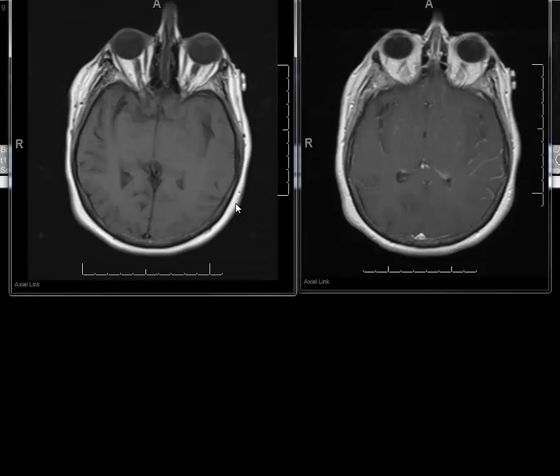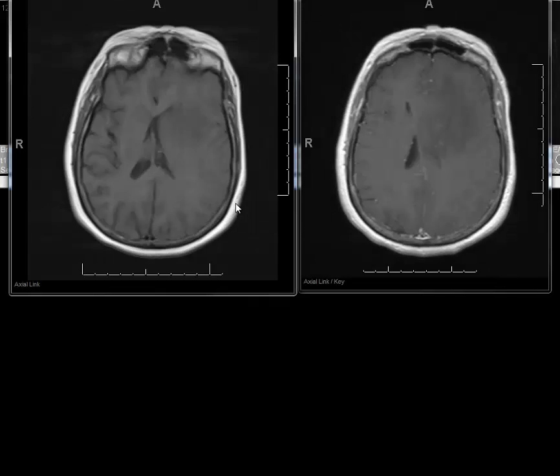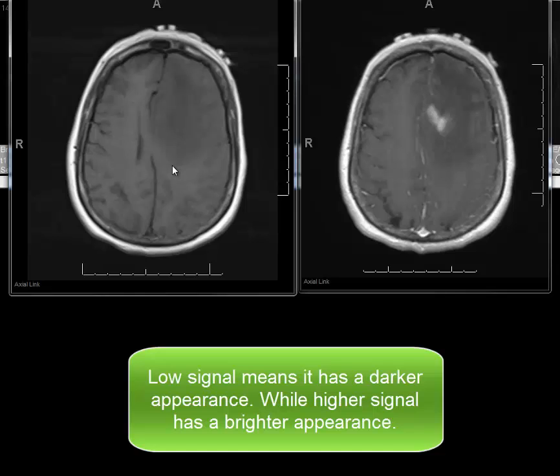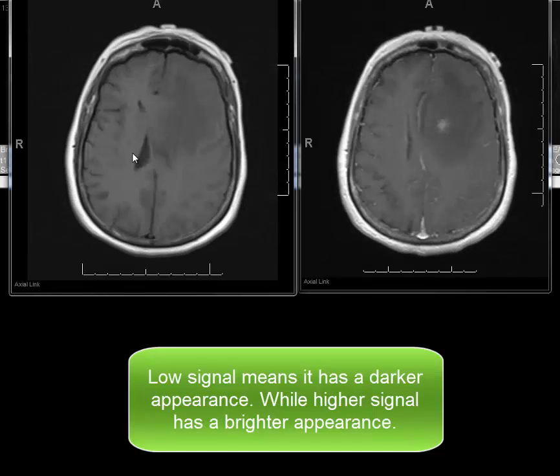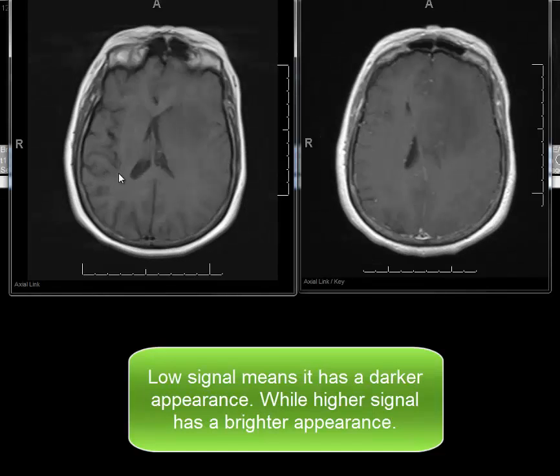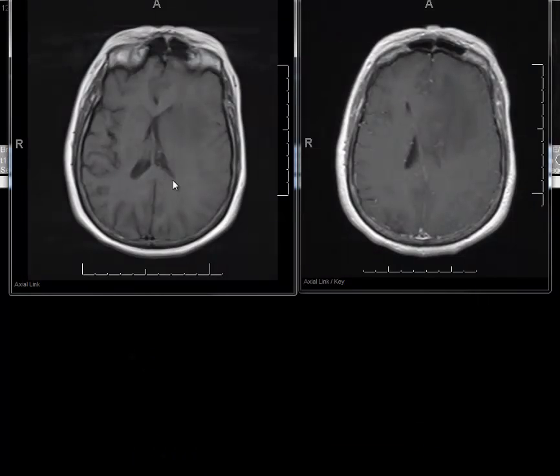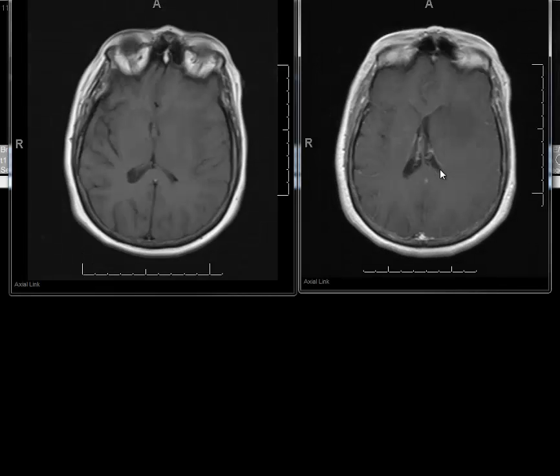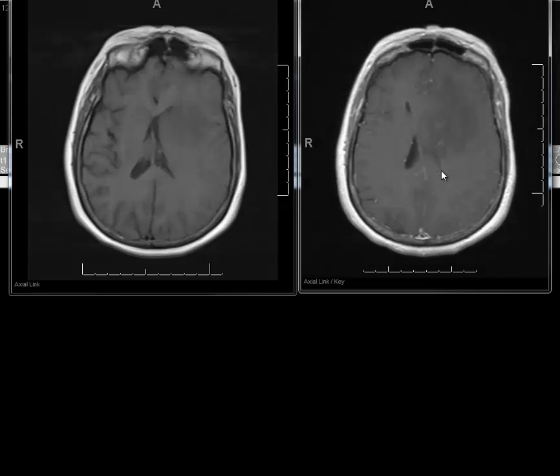In this sequence, the CSF is low in signal, so you can see that the ventricles have low signal. The white matter is brighter than the gray matter. This is employed in conjunction with gadolinium contrast, as seen here on your right side, because enhancing lesions are bright on T1.